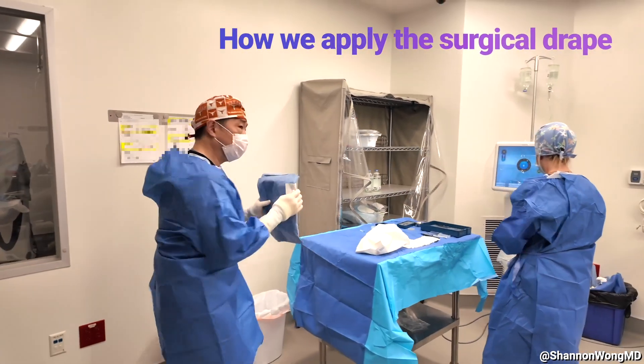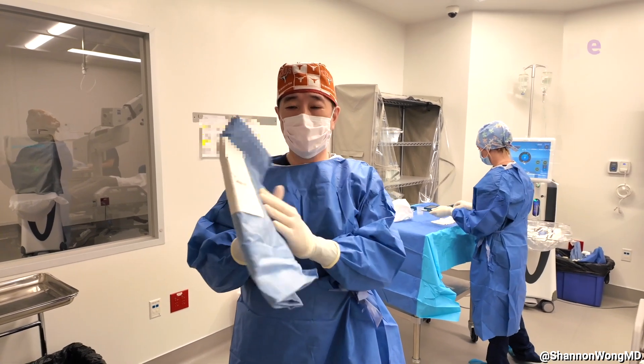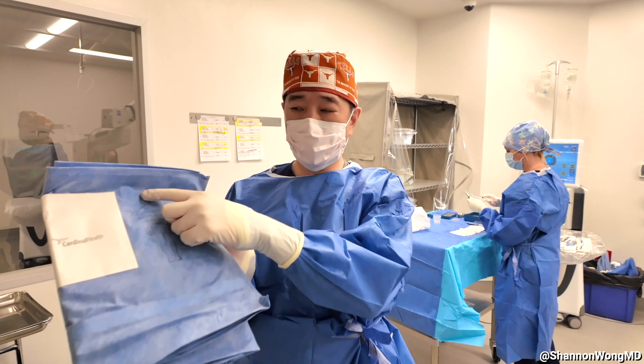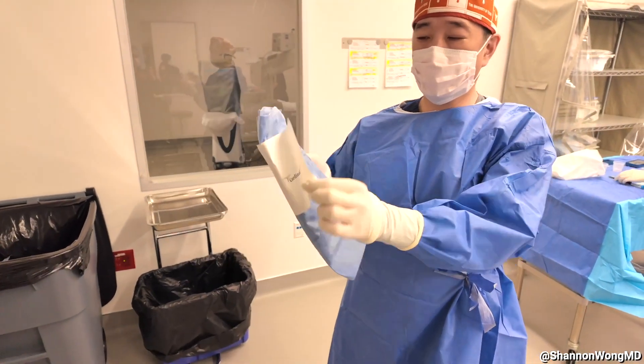Now let's go over how we apply the drape for our patient. This is the drape that comes in our FACO pack. You can see a human figure where the head is at the top, and that will go toward the top of the patient, and the feet will go toward the bottom of the patient.